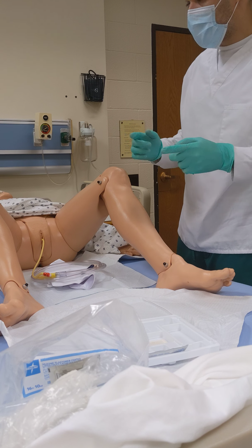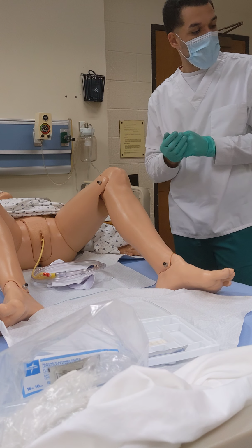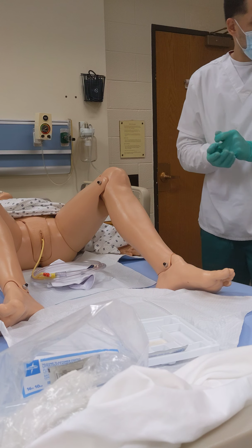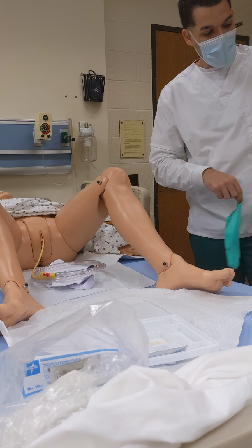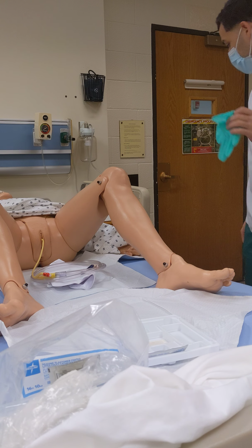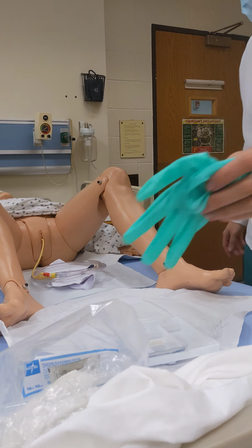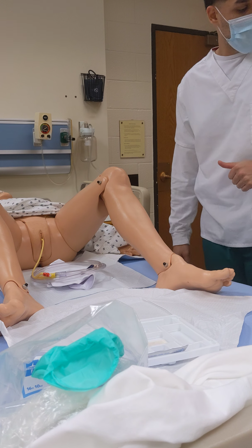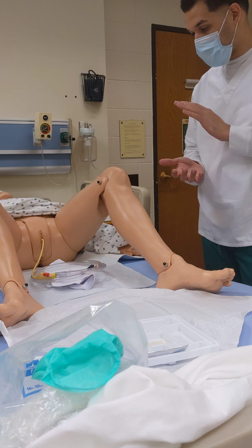Okay, so now I'm going to actually remove these, and I would be cleaning my hand hygiene and applying clean gloves. That does not go there. This goes into the garbage. Hand hygiene, gloves.